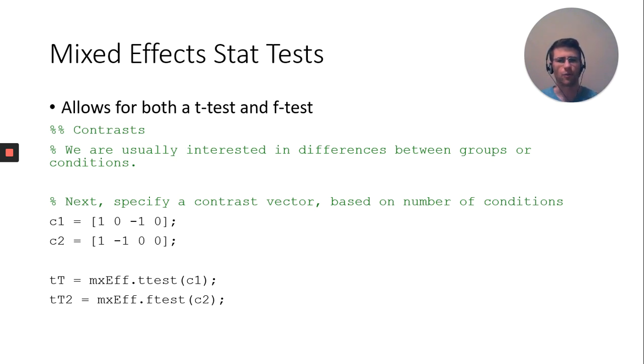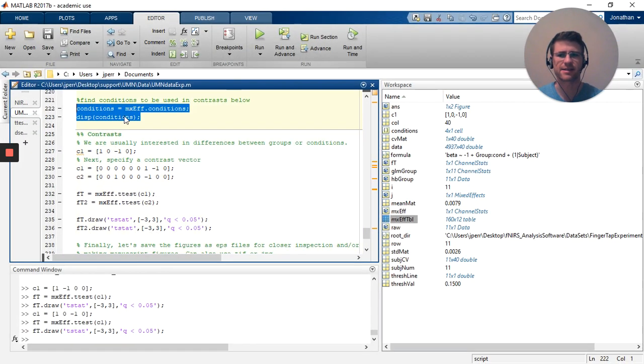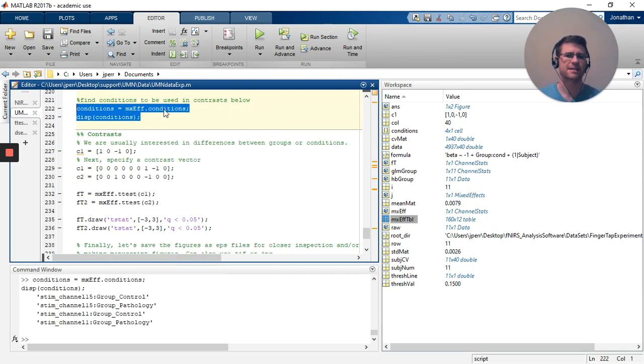What I didn't do is display the conditions. You can use conditions equals mixed effects dot conditions. Here you'll see I have two conditions, stim channel 15 and stim channel 1, and I have a group. So it's the control group and pathology group, control group and pathology group. That's our four conditions that I'm going to contrast using this contrast.